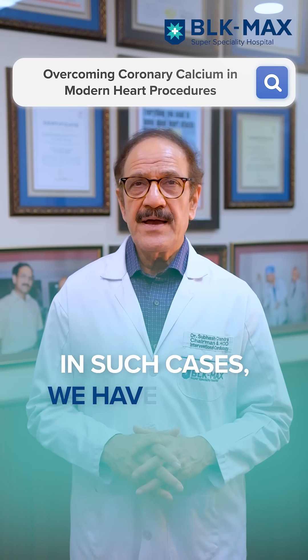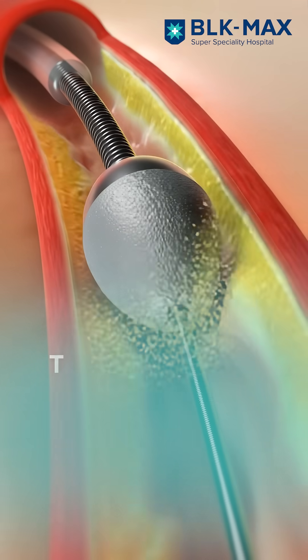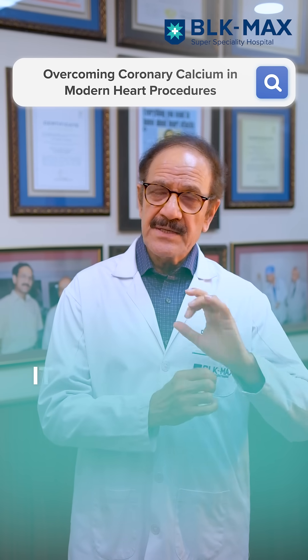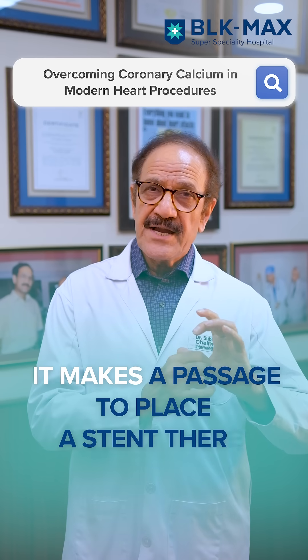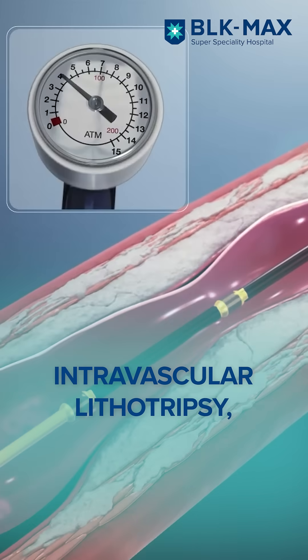In such cases, we have special tools, such as rotablation, which is a diamond-laden bur that rotates at a very high revolution and goes through the coronary artery, making a passage to put a stent there.